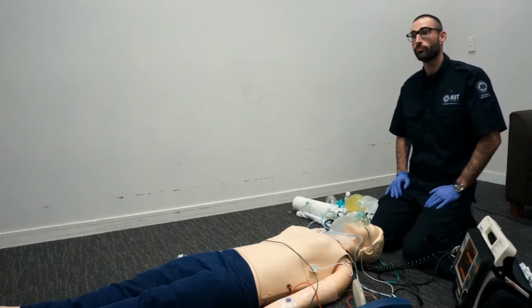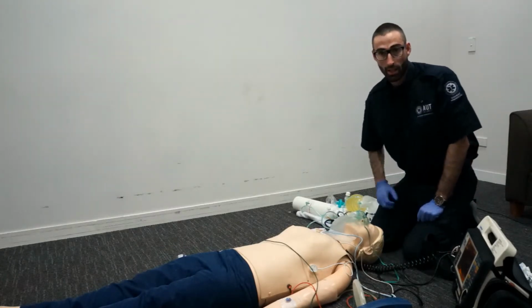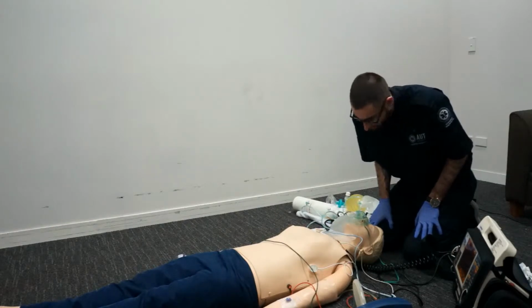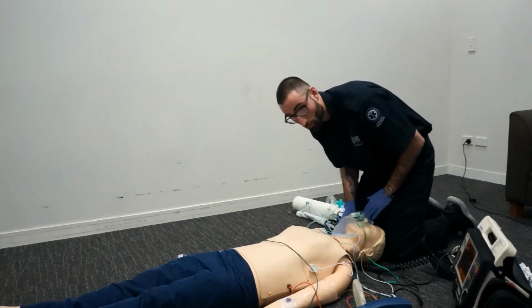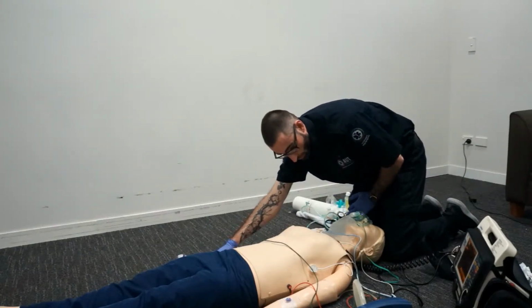Determine the rhythm and the level of cardiovascular compromise. Okay, so we'll print off another rhythm strip and have a look at that. So we still have a wide complex tachycardia and VT. I'll check for a pulse. I still have a carotid pulse, but I have no radial pulse.